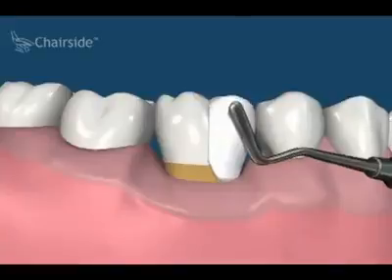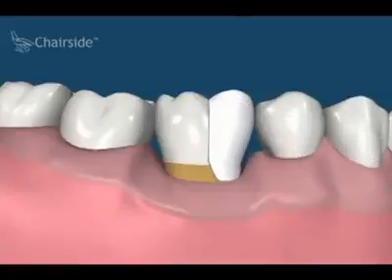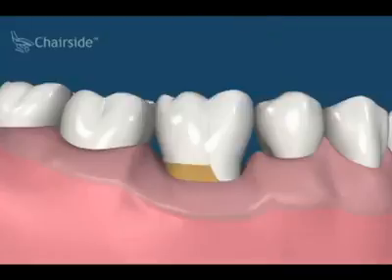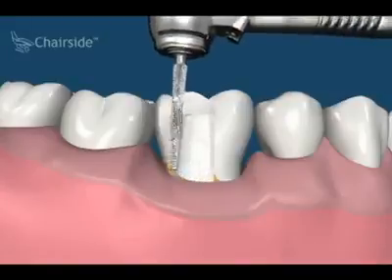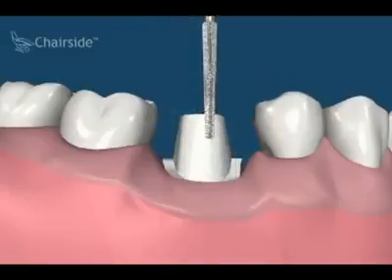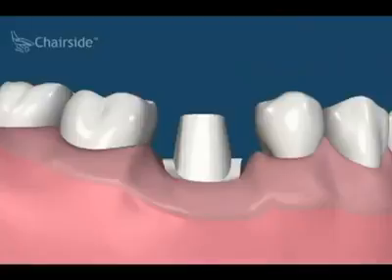In this situation, a light cured resin filling is used first to replace the lost cusp. This may be adequate in some situations, but the best way to restore a tooth with a large fracture is with a crown. The tooth is prepared, and the crown cemented on top.